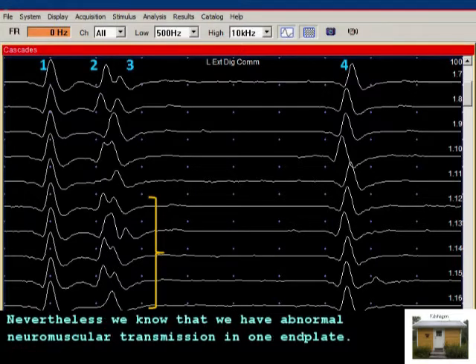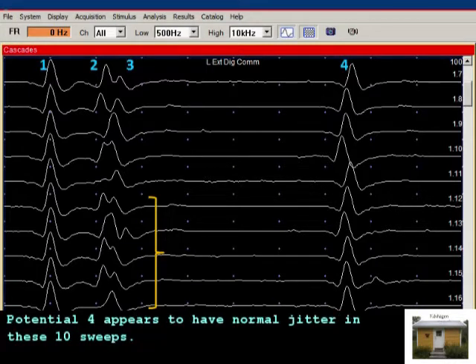Nevertheless, we know that we have abnormal neuromuscular transmission in one end plate. Potential 4 appears to have normal jitter in these 10 sweeps.